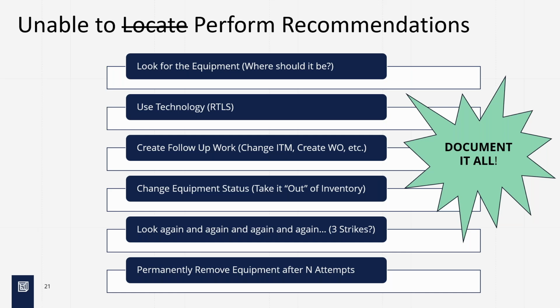So yes, ma'am. My county hospital is very strict about unable to locate. The third week, before the last week of the month, I send out an email per department, so leadership has the accountability for the things we can't find up until then.